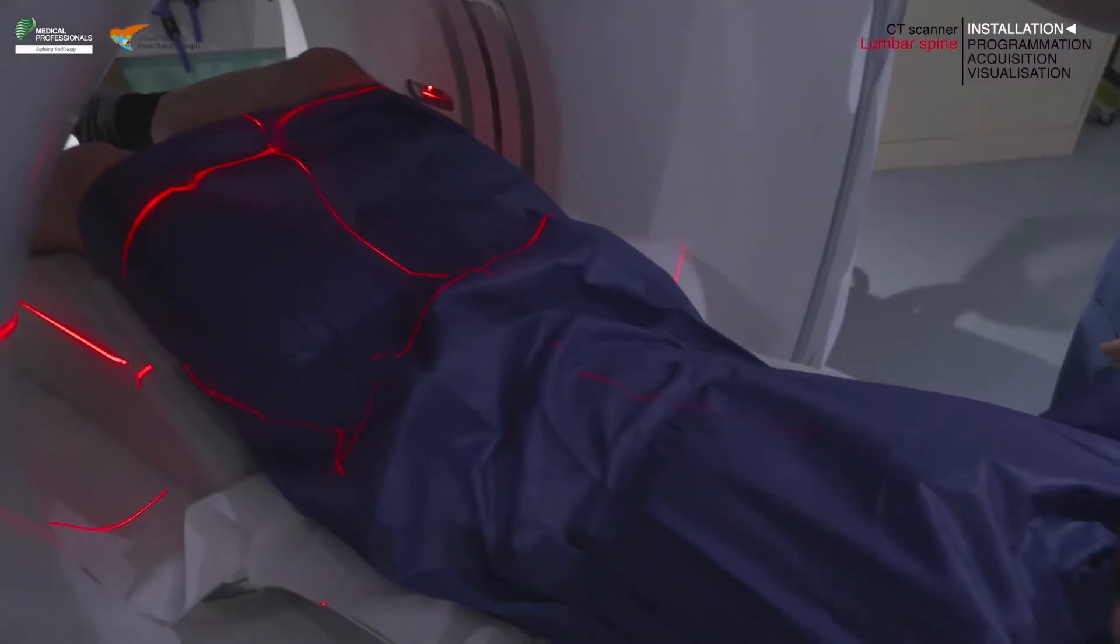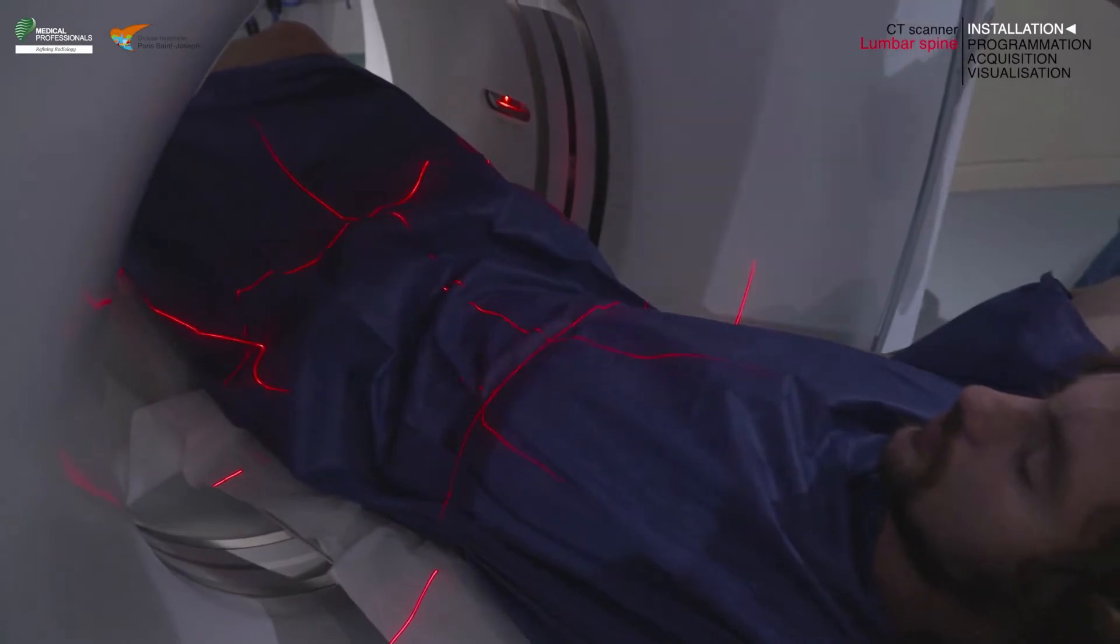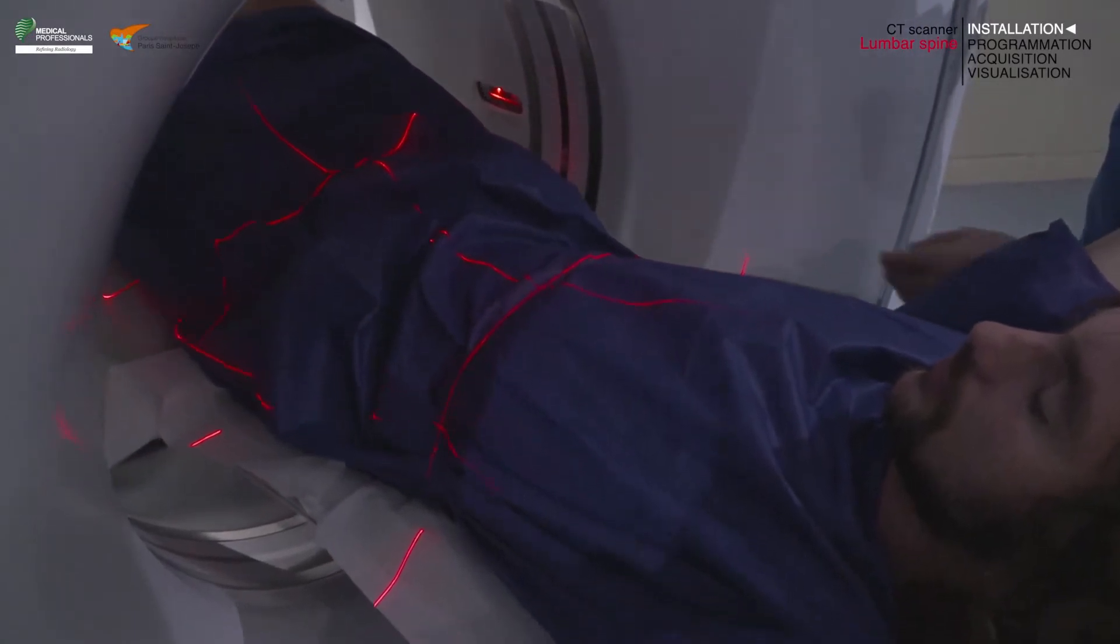Center the internal axial plane laser light on the appropriate landmark. Here we use the iliac crest.